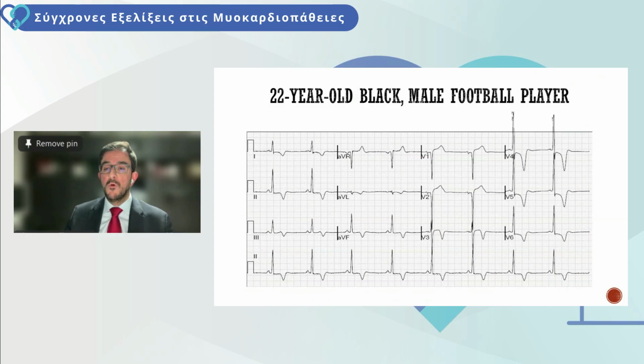This is another ECG that will cause a lot of concern, and even more than the previous one, because here you've got extensive T-wave inversion that affects the lateral, the inferior, and the anterior leads. And in this particular case, also you've got an upward aVR and associated ST segment depression with the deep T-wave inversions in the lateral leads. And beyond that, if you're careful and you look at your leads V1 and V2, you will see that you've got some pathological Q waves. And when you look at such an ECG with such widespread T-wave inversions with high QRS voltages and ST segment depression, the first thing I think is: is it possible that this is apical hypertrophic cardiomyopathy?